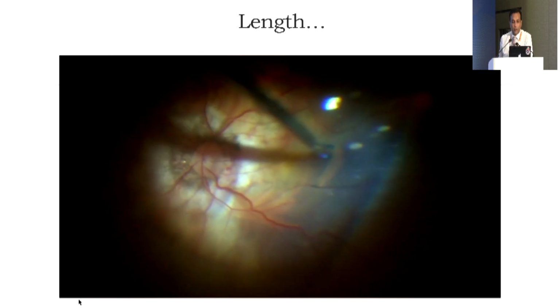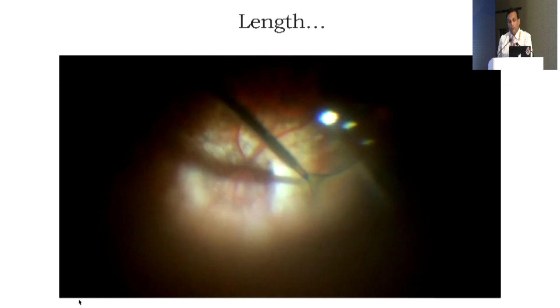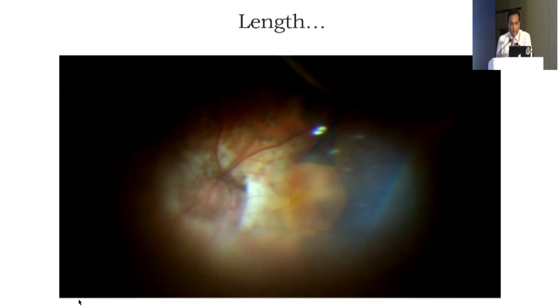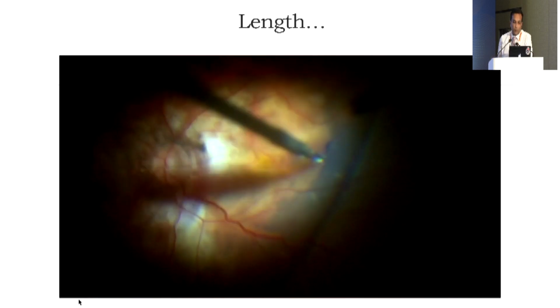So we have posterior trocars, we have magnifying lenses. The other way you can, if you are bidextrous, you can use the left hand. So the ILM was not approachable with the right hand, so in this case I'm using my left hand to peel the ILM. So you have to use multiple ways to come to the posterior pole with your routine instruments.